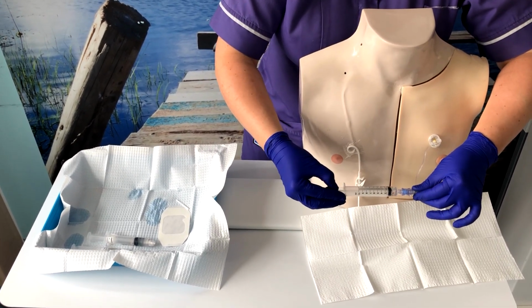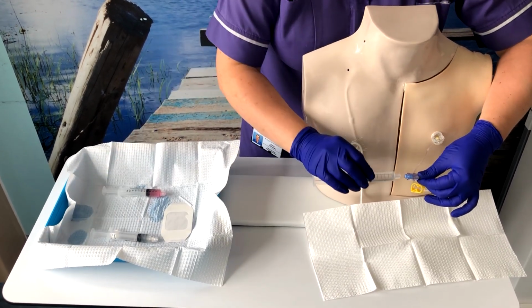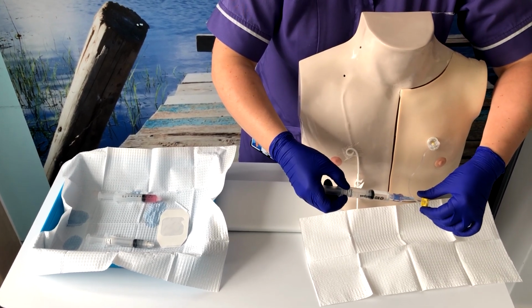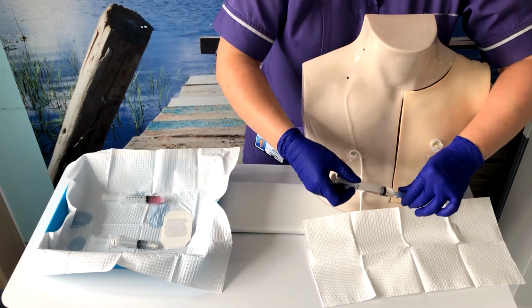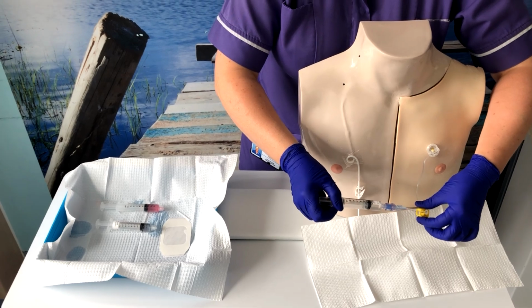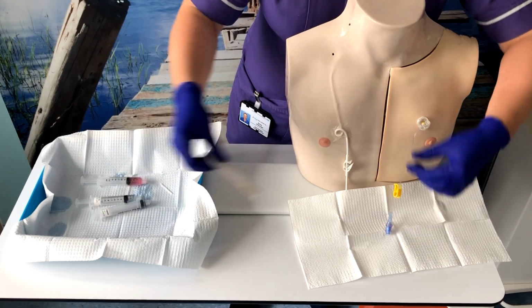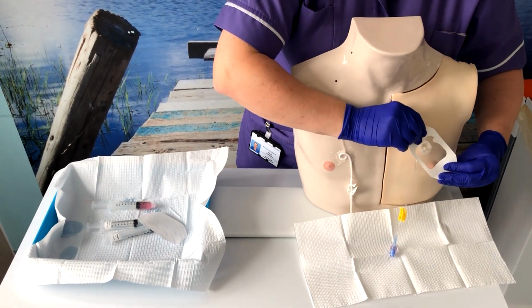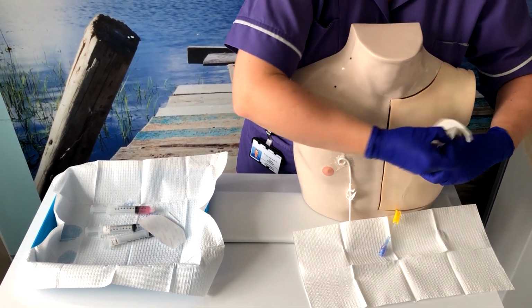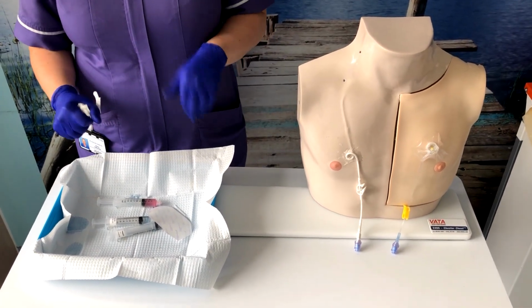We're going to make sure we take our 2 ml discard to make sure it's in the right place. Then we are going to flush with a push-pause technique. And then lock with our heparinized saline. Always clamping under positive pressure. Then you're going to put a dressing over the top to ensure it's secure. That's it. Done.